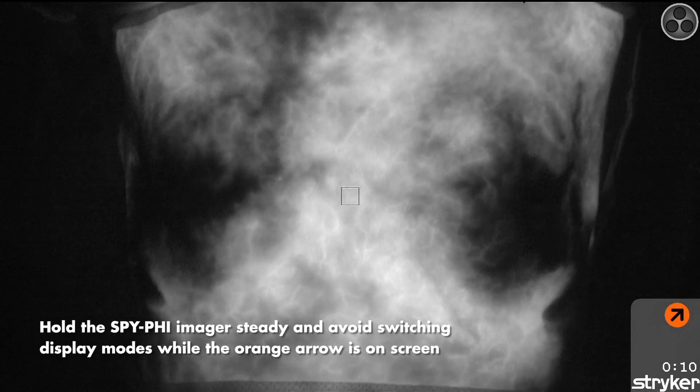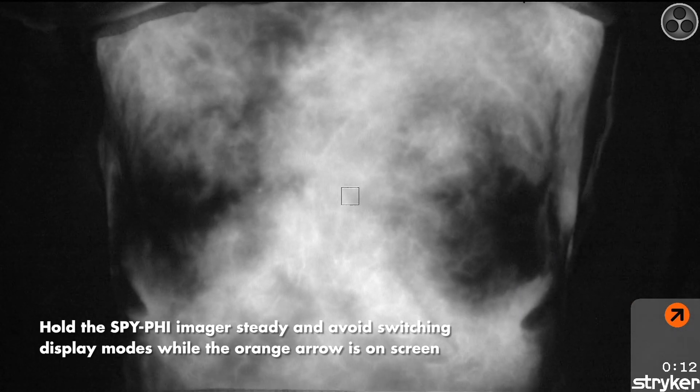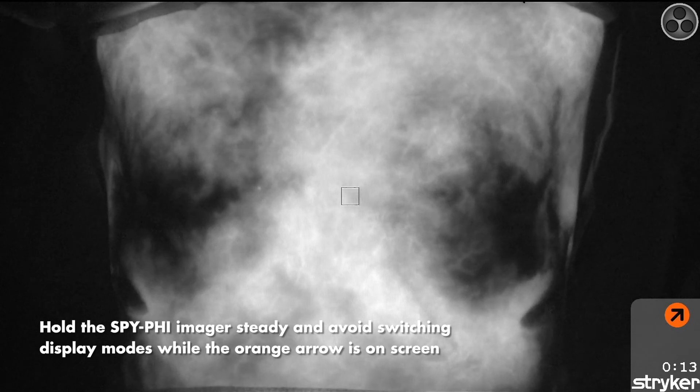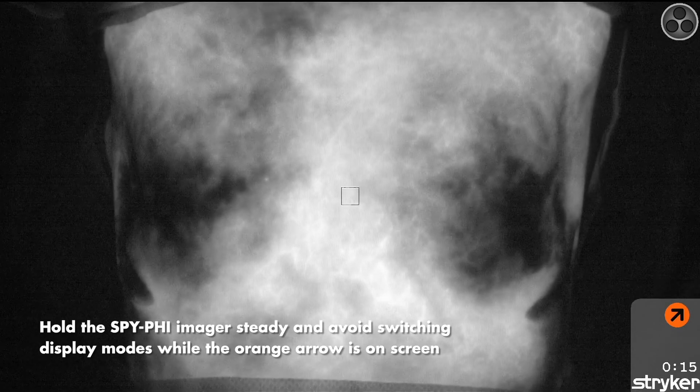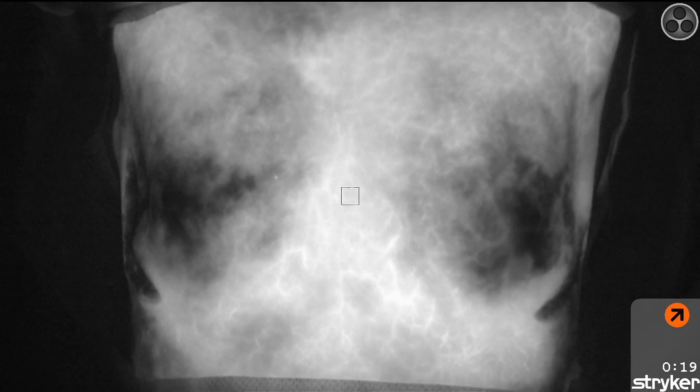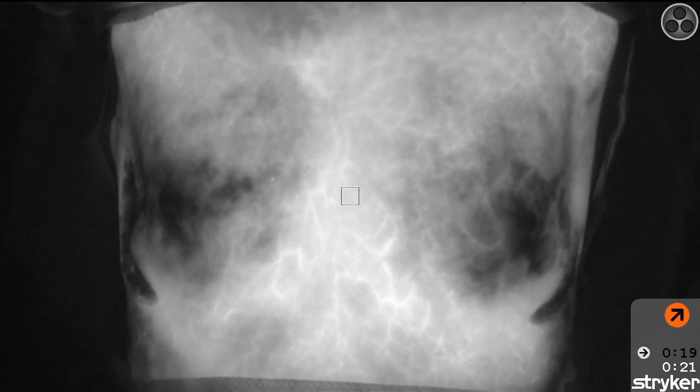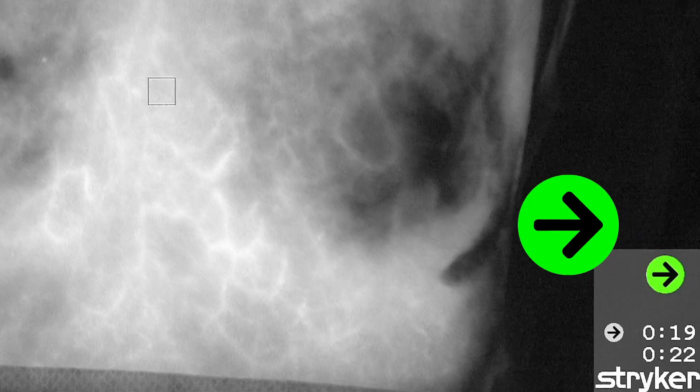Hold the SpyFi imager steady and avoid switching display modes while the orange arrow is on-screen. SpyQP automatically detects when the intensity of the fluorescence signal stabilizes and a timestamp appears in the bottom right corner of the screen. You are approaching the recommended time to assess fluorescence. A green arrow in the bottom right corner of the screen indicates that the fluorescence assessment window has been reached.